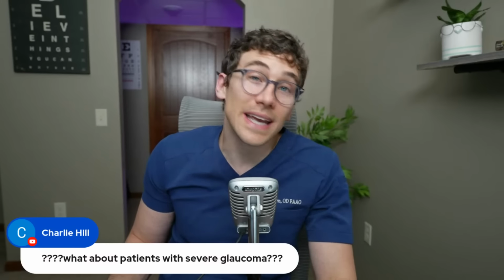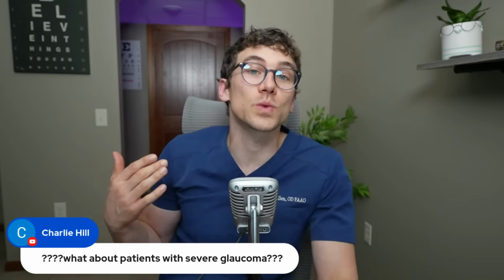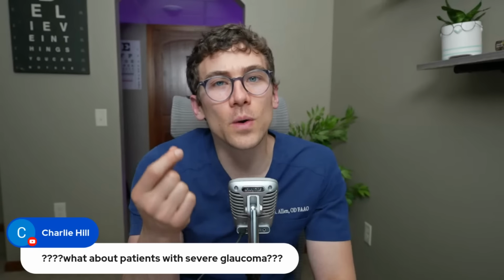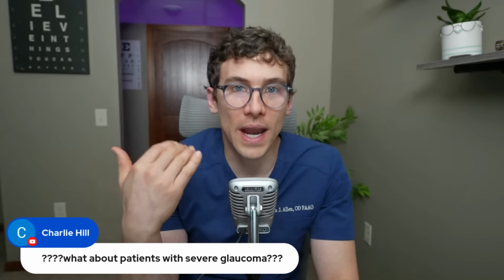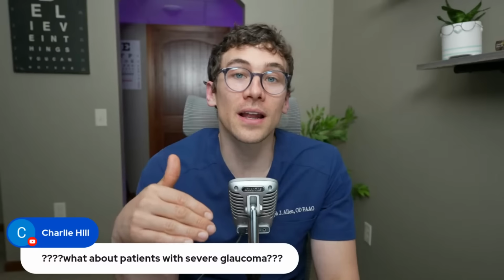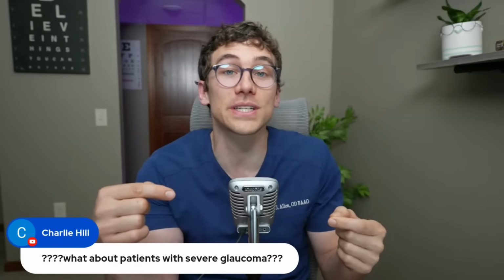But usually cataract surgery lowers eye pressure just a little bit. And now there's what's called MIGS procedure. These are micro-invasive glaucoma shunts. They basically drain fluid from inside the eye, so they can lower the eye pressure. A lot of patients who get cataract surgery can have MIGS at the same time, during the same procedure.